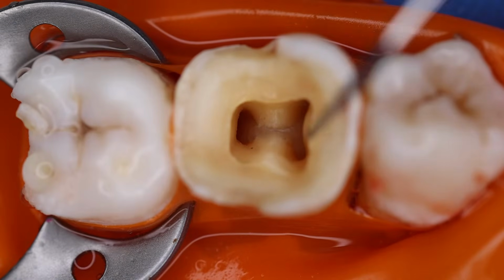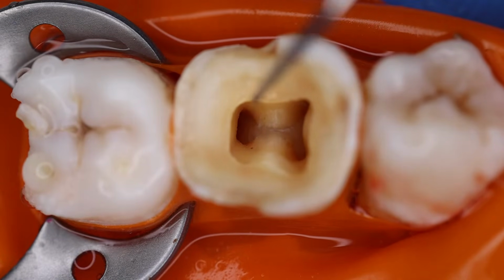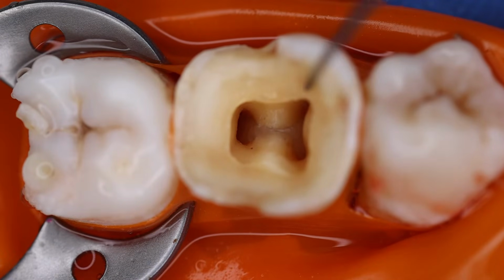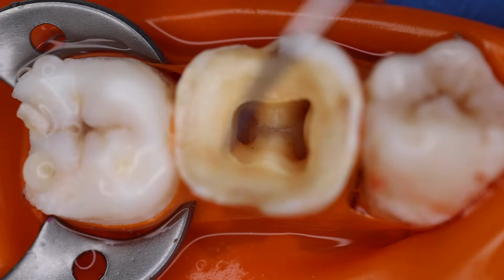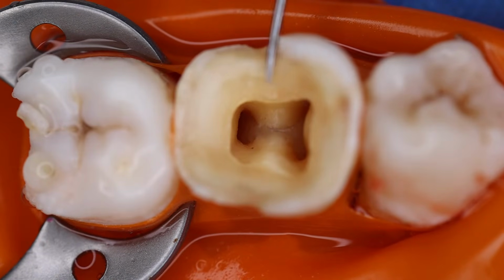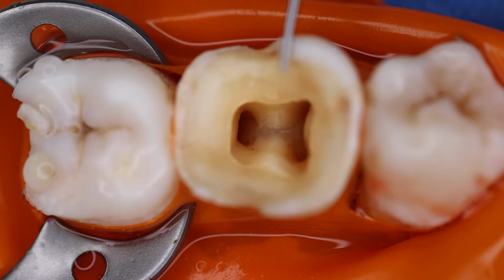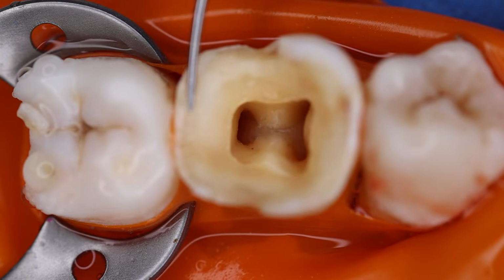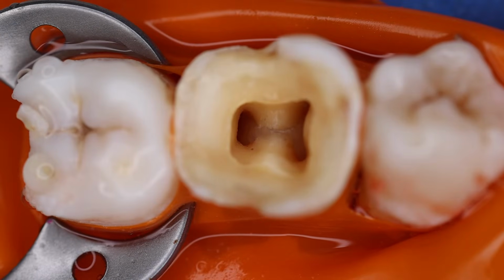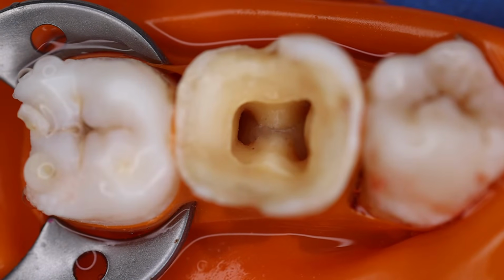We have identified the canal orifices constrained inside in the central area. There is no pulp tissue; it has regressed, and this should be the approach. If you feel that there is any brittle structure or the reference point is liable to break, you can just retain the healthy tooth structure and then proceed with your identification of the canal orifices and further.